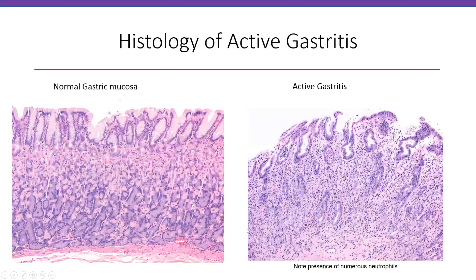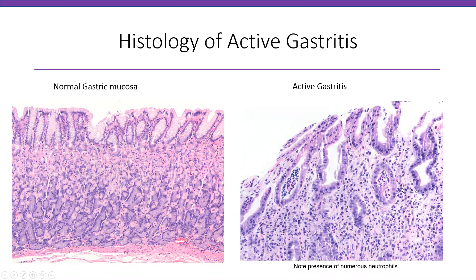Let's look at the histology of active gastritis. This is normal gastric mucosa with gastric foveolar epithelium, epithelial cells, and the muscularis mucosa layer. When you have active gastritis, you can see numerous neutrophils damaging the surface — the surface does not look healthy, there is not much mucin left, and there is a lot of inflammation. In the higher power picture you can see neutrophils in the pits and in the lamina propria between the epithelium.